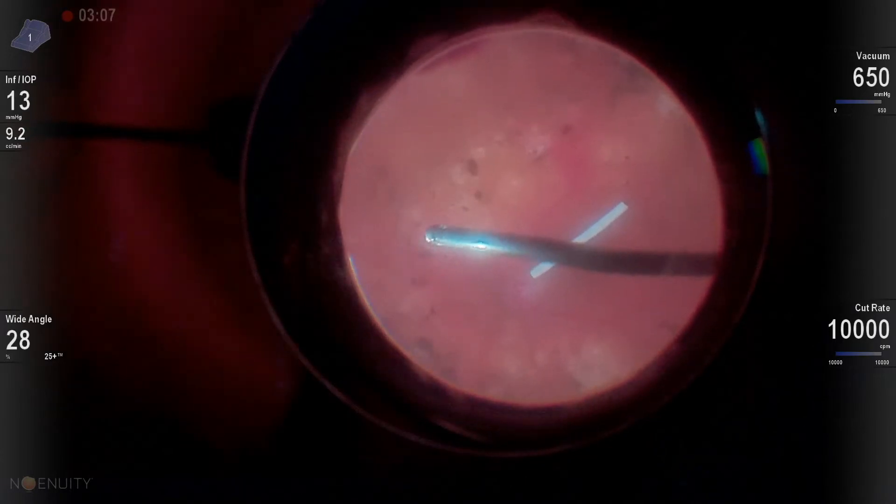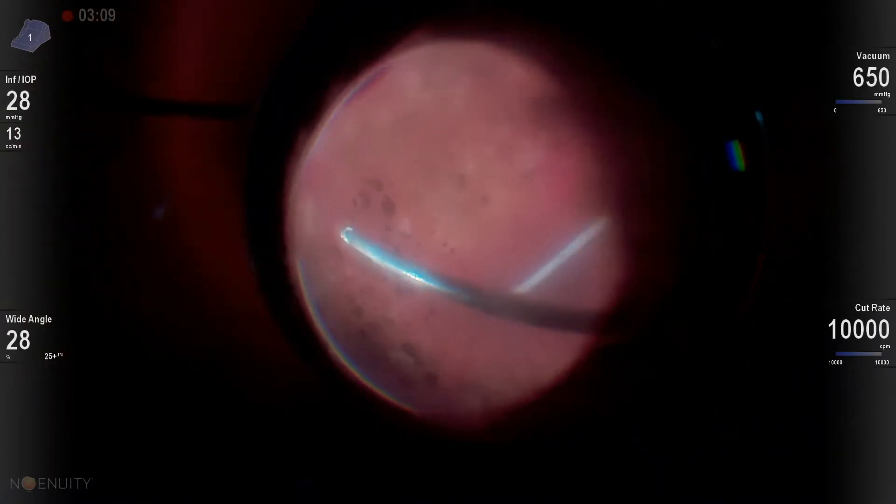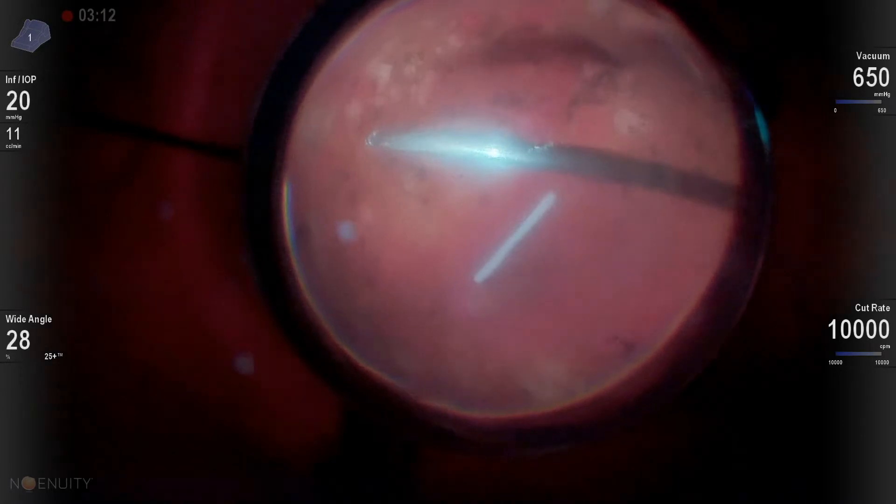Why I think this video is of moderate interest is just to see how an Ozurdex behaves when doing a vitrectomy.